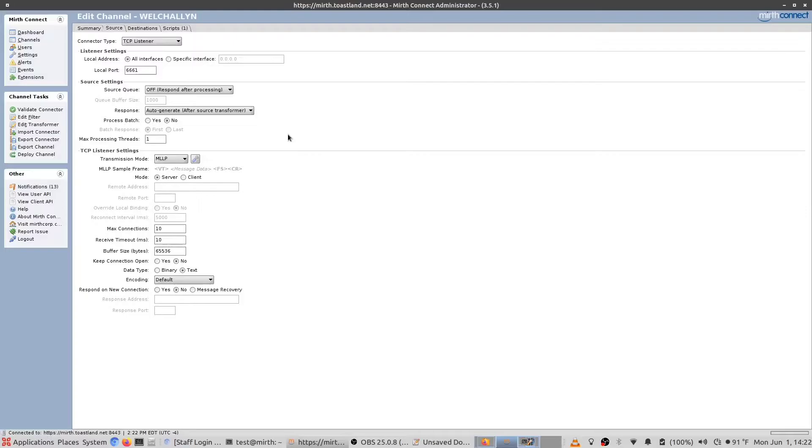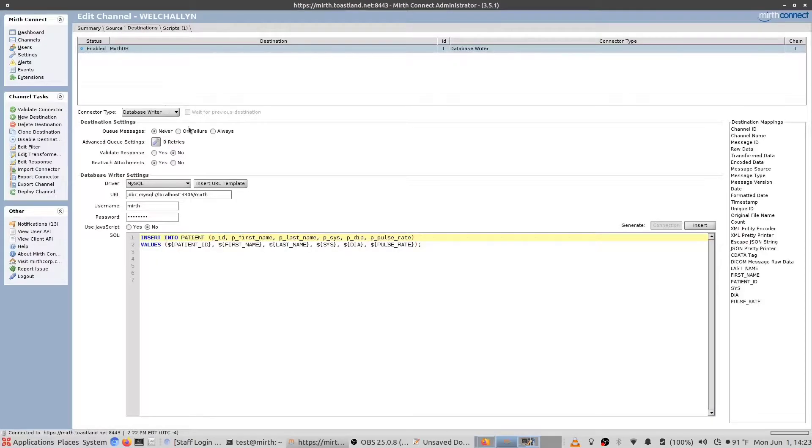This involved an intermediate program called MirthConnect, which is able to interpret HL7 messages and convert them into something that a database can understand.